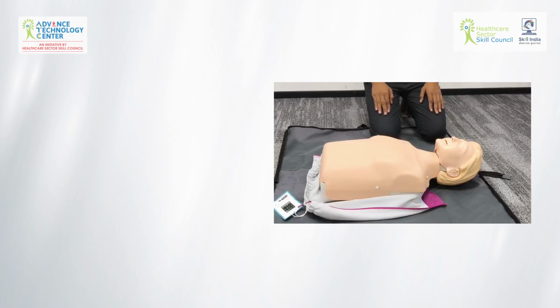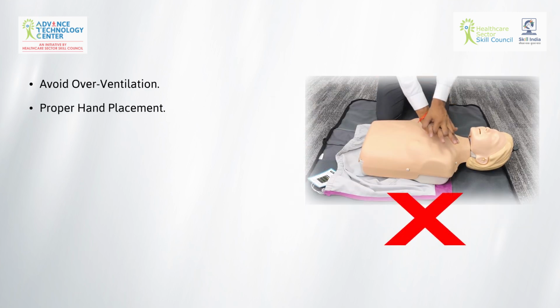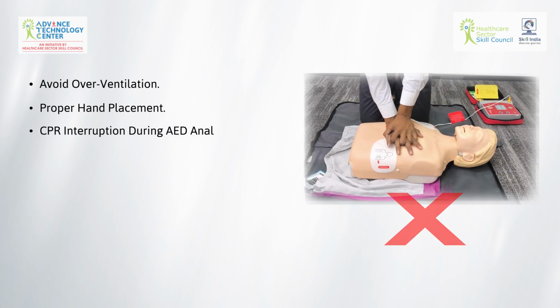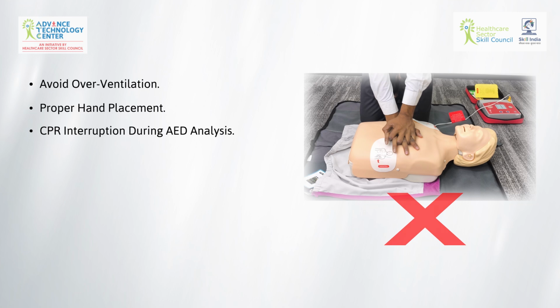Common errors to avoid. Avoid overventilation. Do not hyperventilate the patient. Proper hand placement: incorrect placement reduces effectiveness. CPR interruption during AED analysis: chest compressions should be paused only when the AED is analyzing.